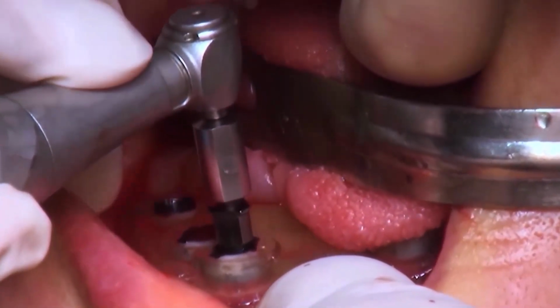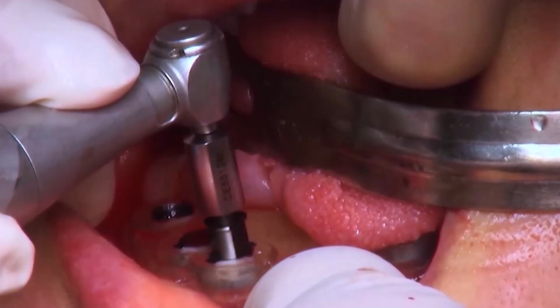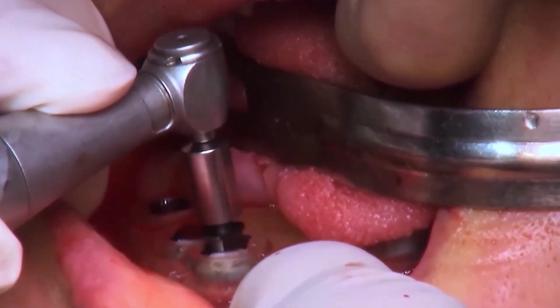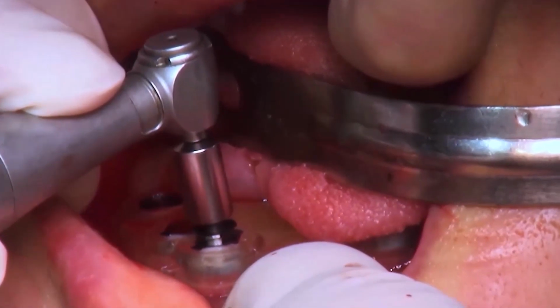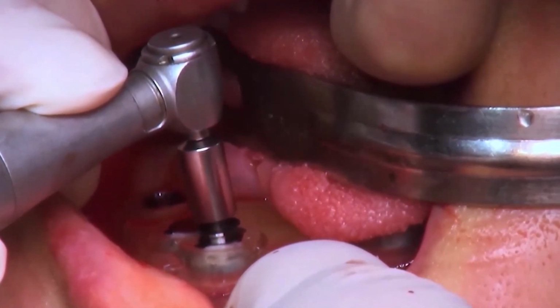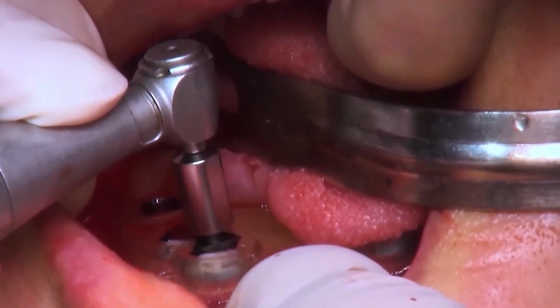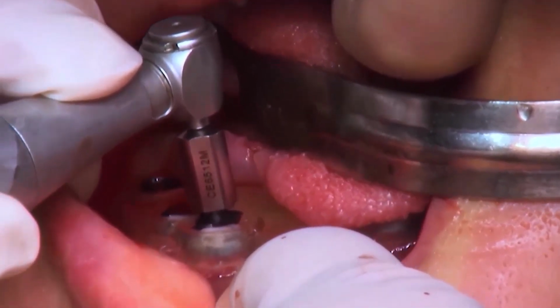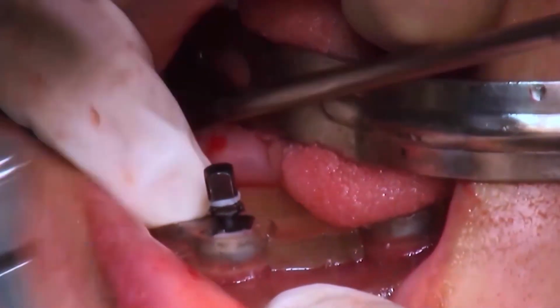The implant is placed with a speed of 30 RPM, with a torque of 30 Newton centimeters. Once it is fixed with a 30 Newton centimeter torque, I increase the torque.